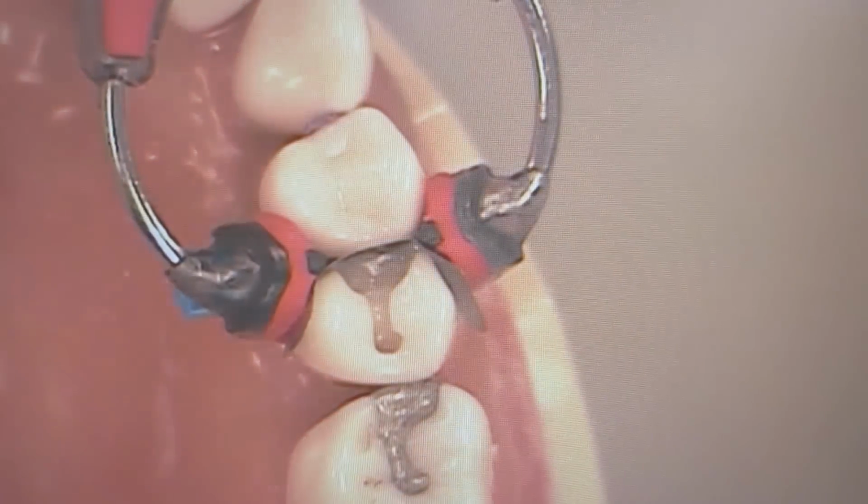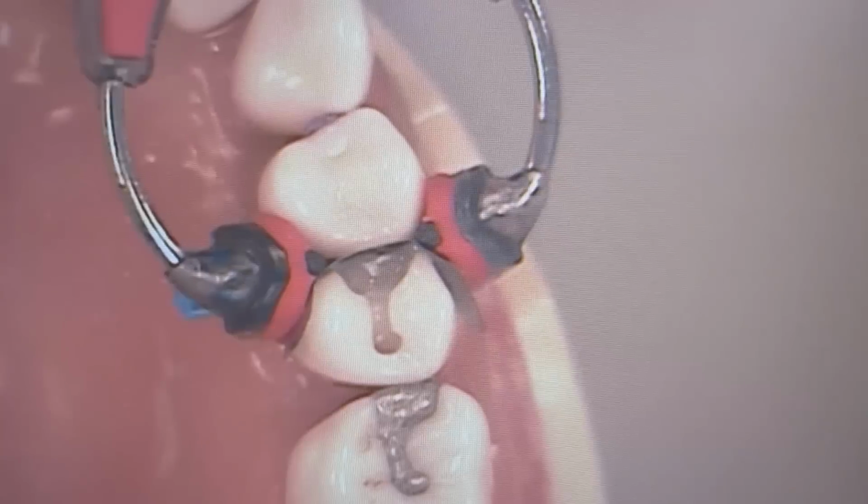So, Dr. Chui, did you basically do two flat layers? You built up the box to the pulpal level? Correct. Okay. So there are different ways you can do it, Dr. Watanabe, meaning do a triangular maneuver. For me, it's easier to just do a flat layer on top, as long as I do layering.